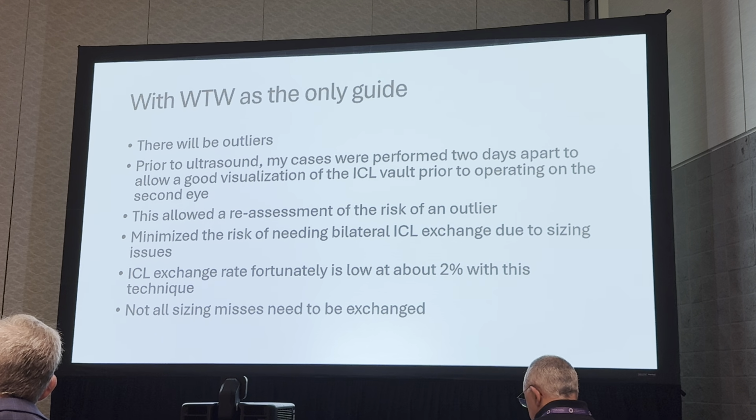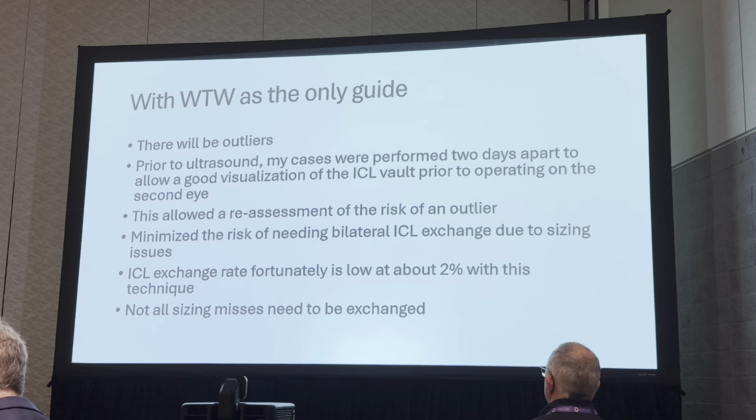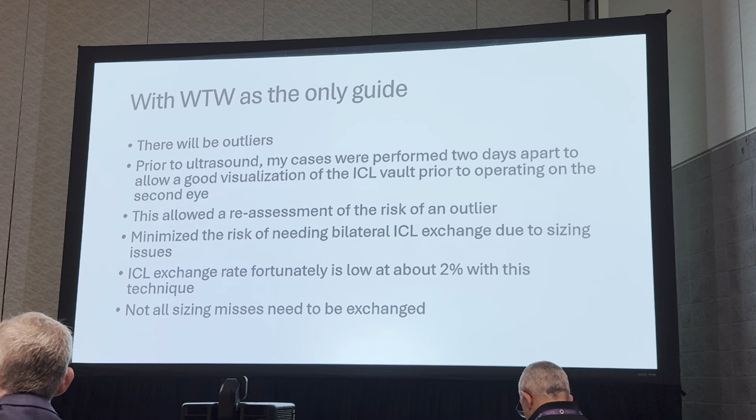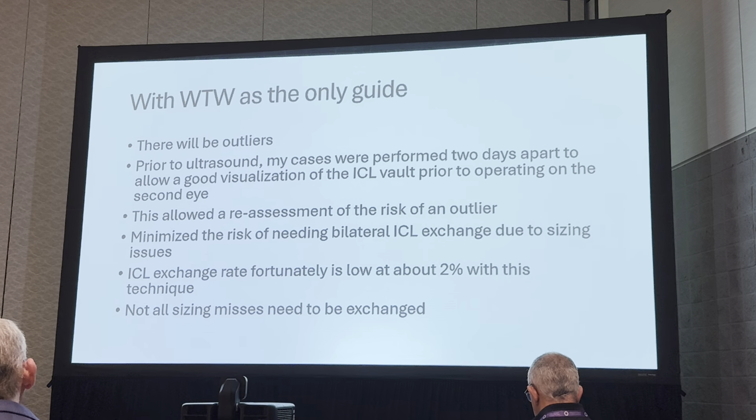So my recommendation is if you are using white to white, don't do them both on the same day, okay? Separate them by a day or two, whatever it takes. With this technique, my personal exchange rate was about 2%, which is in line with pretty much all the other data that's been presented using white to white. The good news is not all sizing misses need to be exchanged, especially now with the EVO.